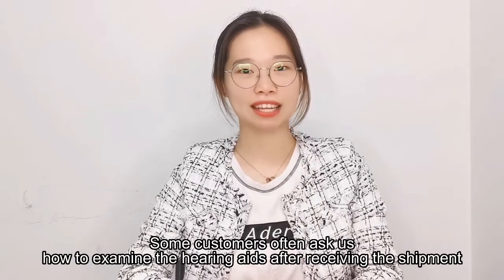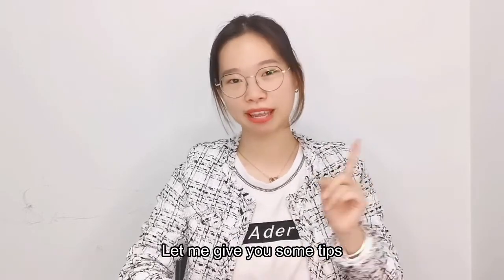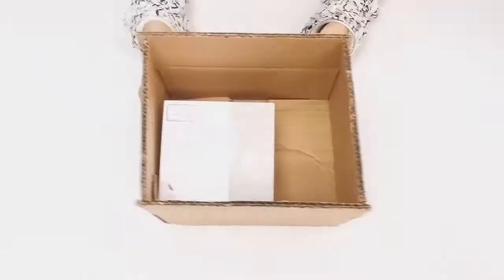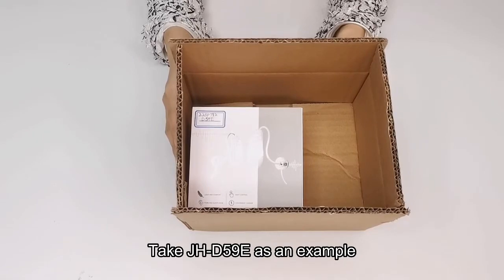Some customers often ask us how to examine the hearing aids after receiving the shipment. Let me give you some tips. Take JHD59E as an example.